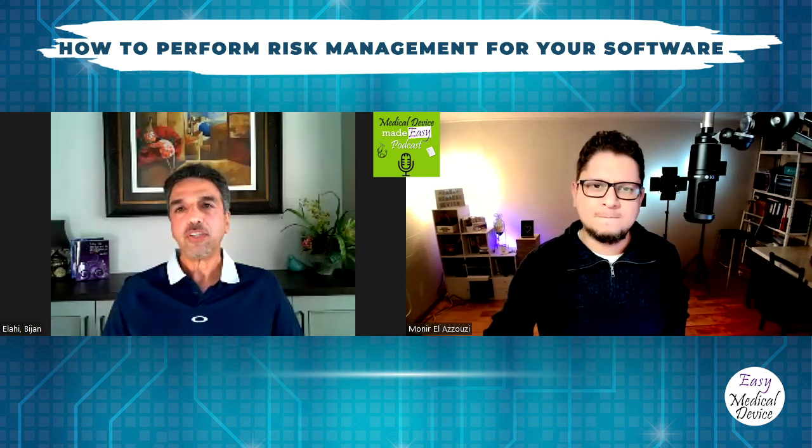Oh, definitely not just the quality person. Risk management is a team activity. And really, if you ask me who should own risk management, I would say systems engineering. Systems engineering, of course, has the broad knowledge of how the system works, its environment, its interactions with the humans. And then besides that, your quality, your medical safety, clinicians, all these people need to work together, and of course software engineers too. You can't just rely on the quality people.